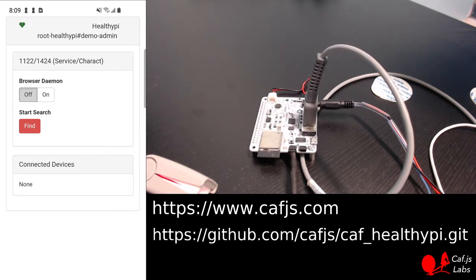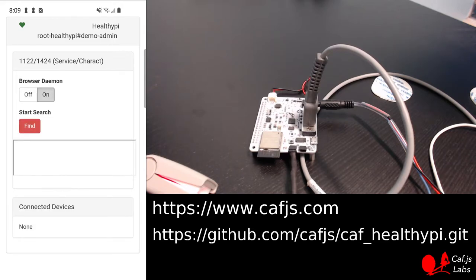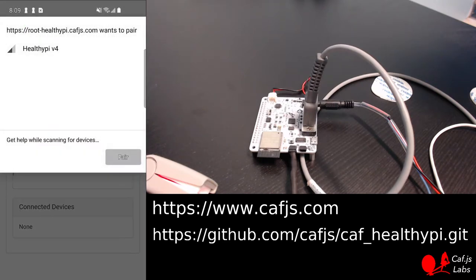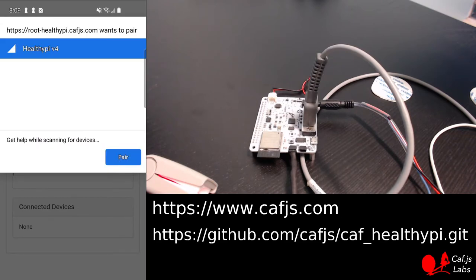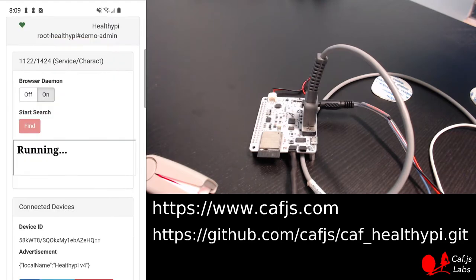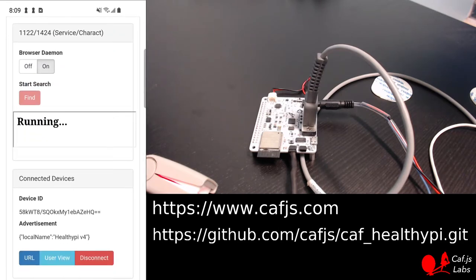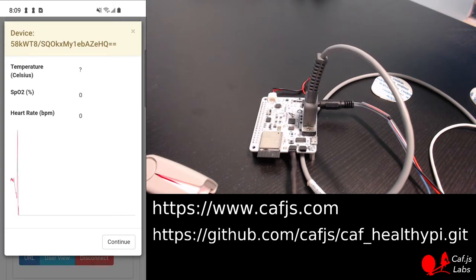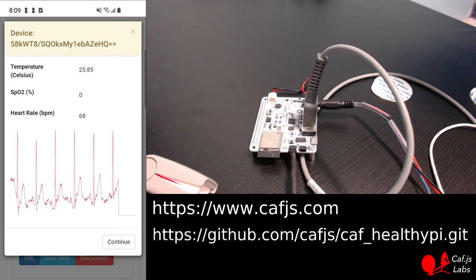The first thing we do is to start the scanning process to find the Healthy Pi using the Web Bluetooth API. We find Healthy Pi and pair with it. Now we confirm and we are already connected to the Healthy Pi, and we can check the state data simply by creating a user view. And that's my heart.